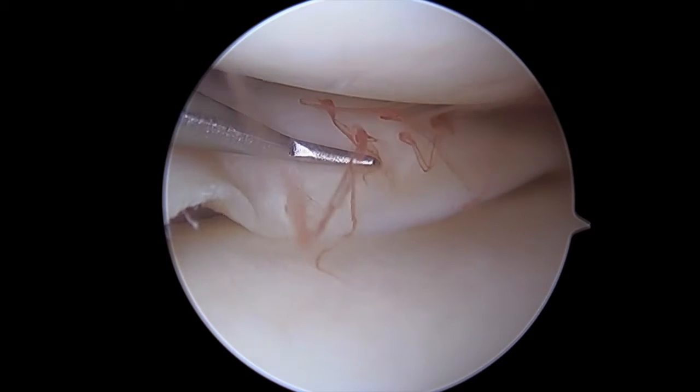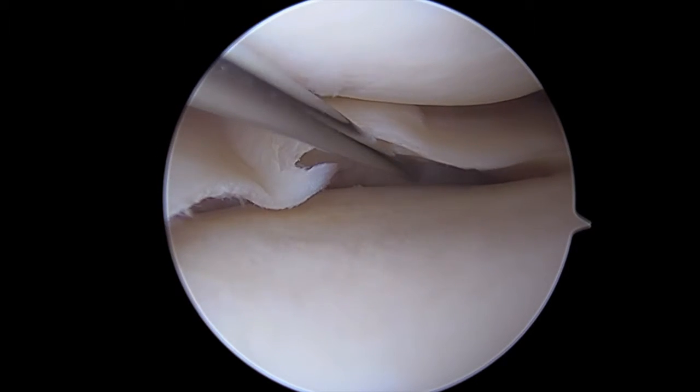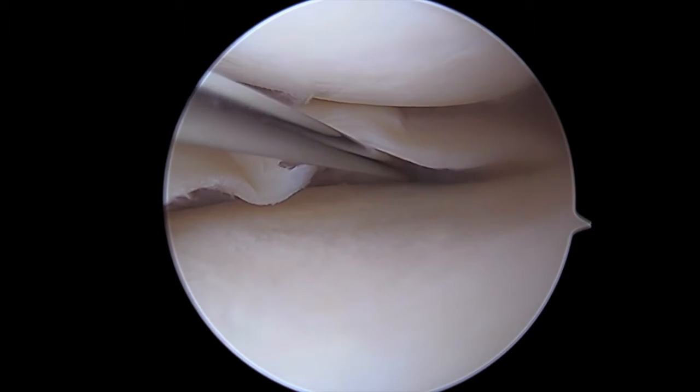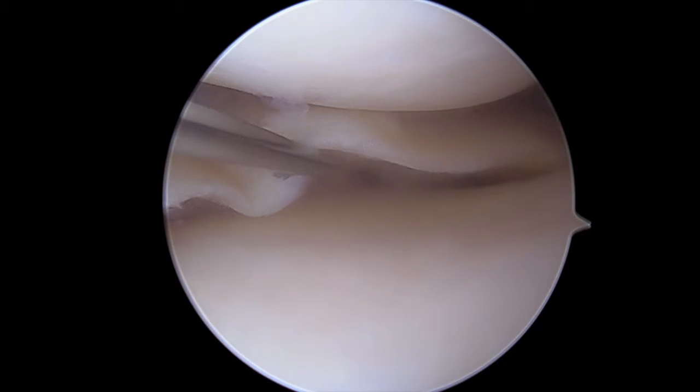We start out by first assessing the meniscus repairability. This is a young patient, and we know that this is a repairable tear. So we're going to ascertain the edges of the meniscal capsular junction tear and then proceed with fixing this back to the meniscal capsular margin.